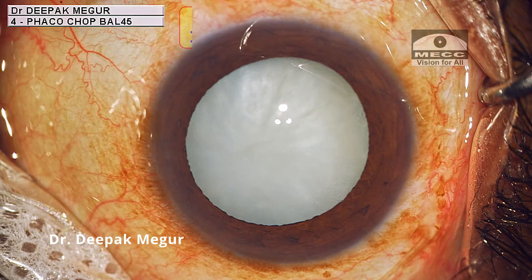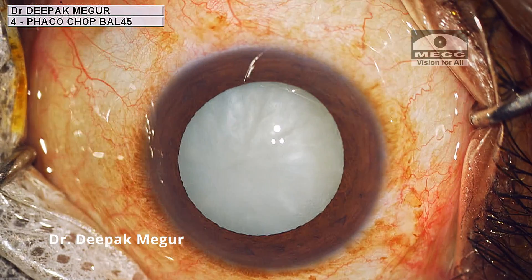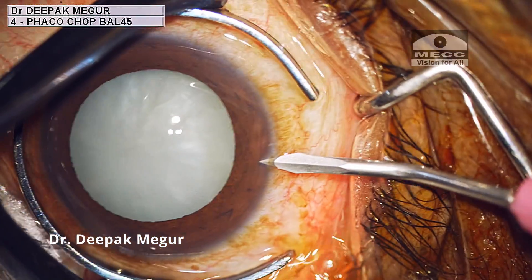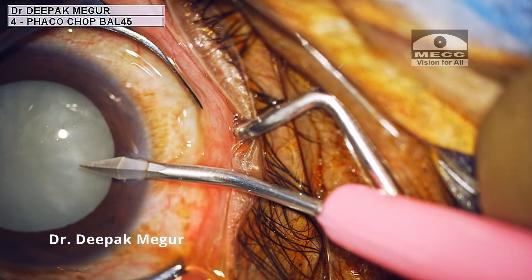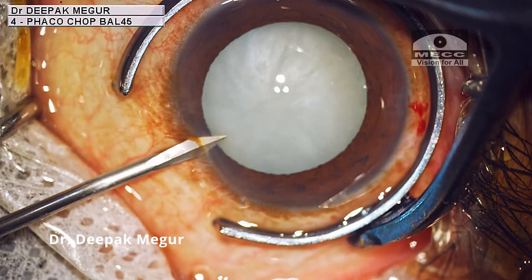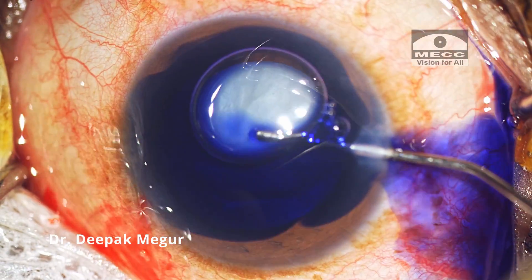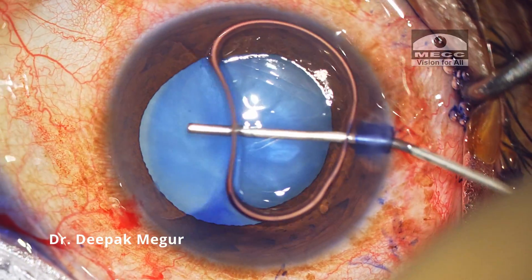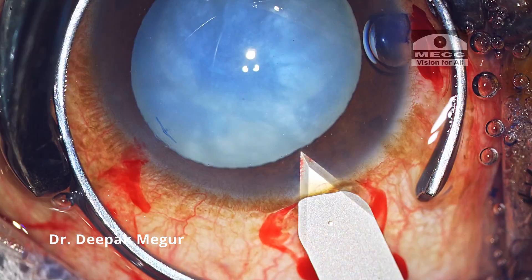Today's case is an intumescent lens in a middle-aged patient. The cortex is swollen and the clinical examination suggests that this variant does not have any pockets of fluid between the cortex fibers, but in fact the cortex fibers themselves are swollen, suggesting a cortex with a jelly-like consistency. This can be challenging to decompress the bag, and in such cases we have a high tendency of radial extension of the rhexis.